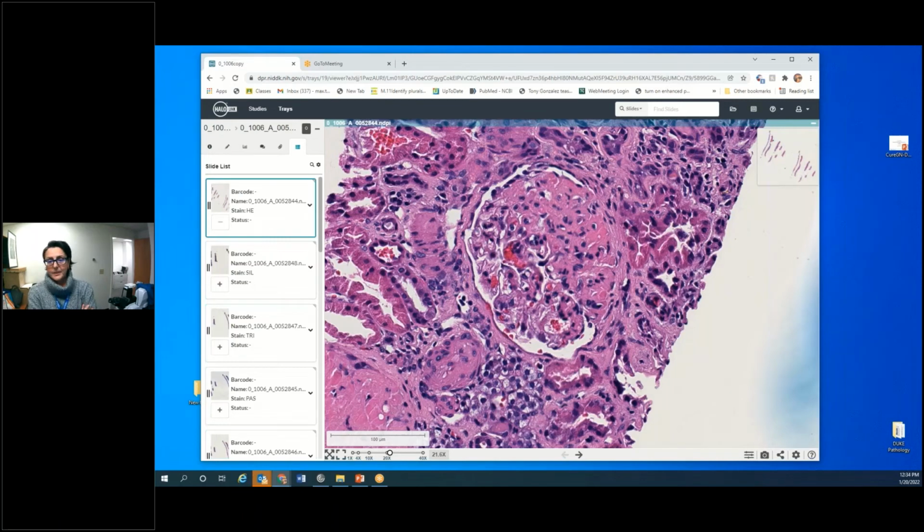Every time I have to do scoring, I use my computer at home or at work, which has two screens, because one is the scoring sheet and one is the viewing screen. Obviously, everybody does it differently, but I think using too many spreadsheets and then copying them may generate errors.